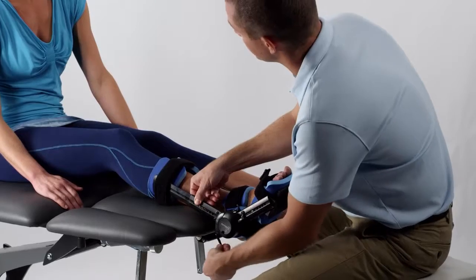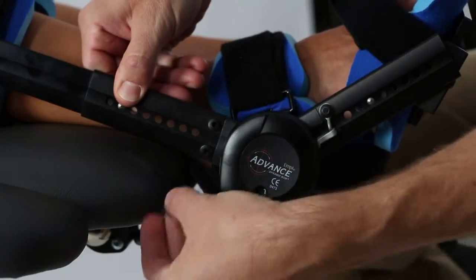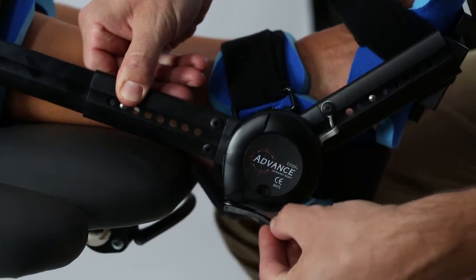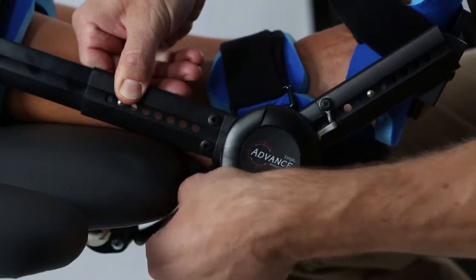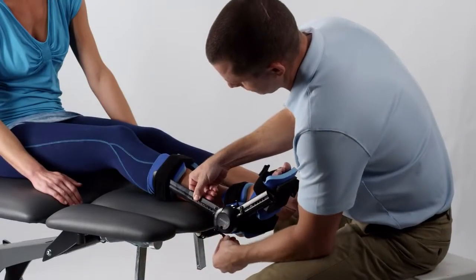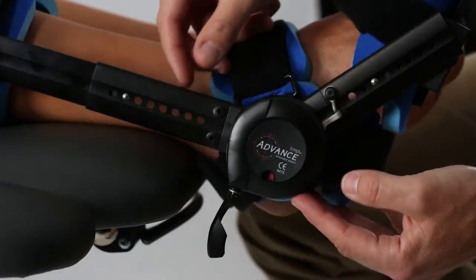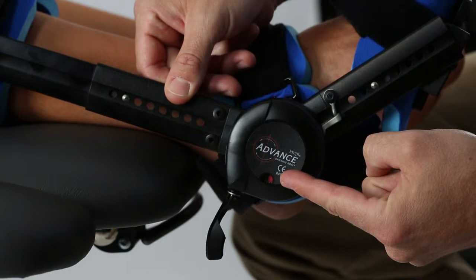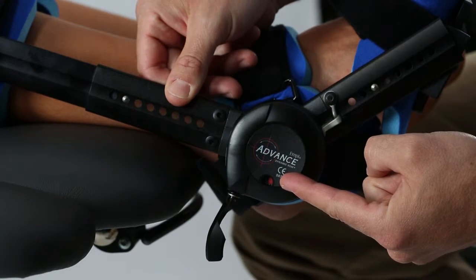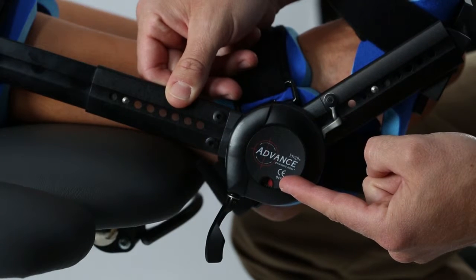If the patient can comfortably wear the device during this initial period, the treatment time can be increased. To increase or decrease the torque, flip the tension control lever away from the tension spring cover and turn the lever in the desired direction. It's very important not to over-tighten or over-loosen the tension spring. Either action can damage the mechanism. A solid red bar in the tension indicator window before 0 or after 10 is a warning signal that you've turned the lever too far in either direction.